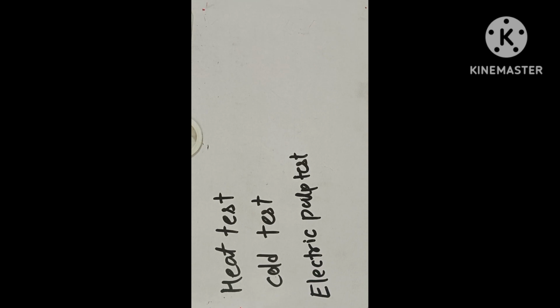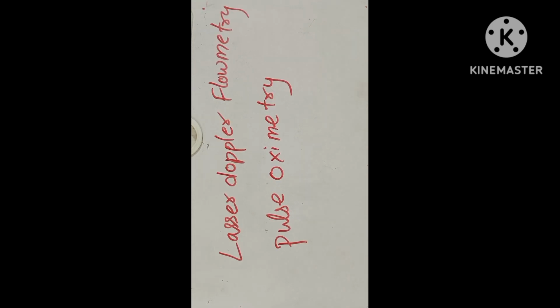We also have some special tests. We have some specific tests like laser Doppler flowmetry and pulse oximetry to measure the pulp blood supply. But these tests have not been developed to the point where they are useful on a routine clinical basis.